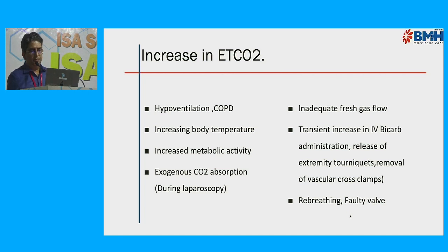Then if there is increased CO2 production, blood bicarbonate administration, increased catecholamine production or catecholamine administration, then parenteral nutrition. Hyperalimentation. Hyperalimentation, okay.